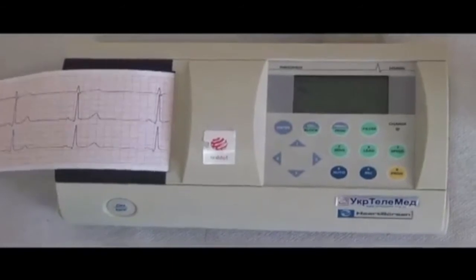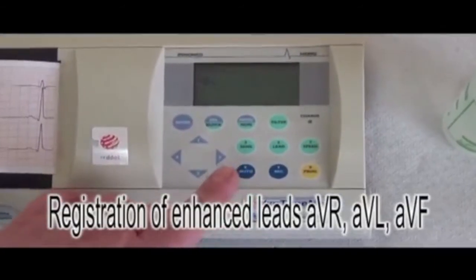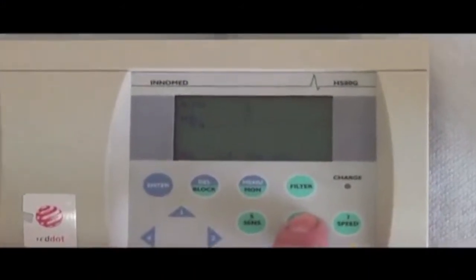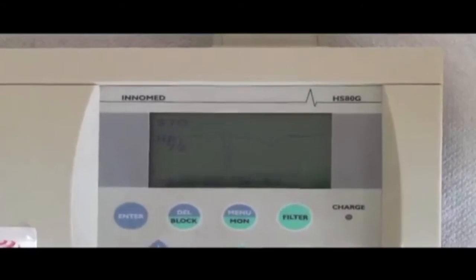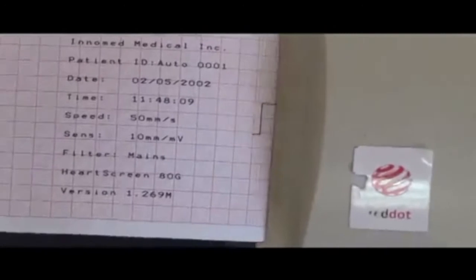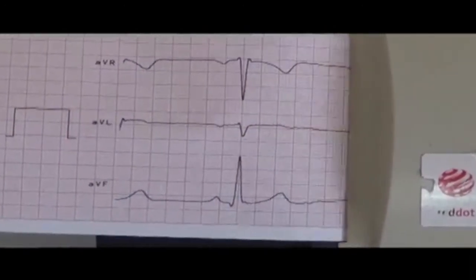The next step is registration of the enhanced limb leads AVR, AVL, and AVF. Register four to five complexes for each lead, then turn off the tape.